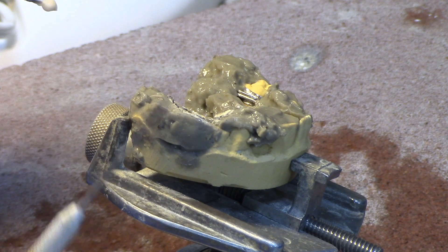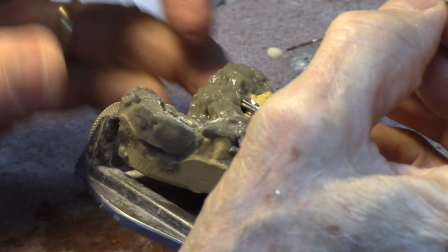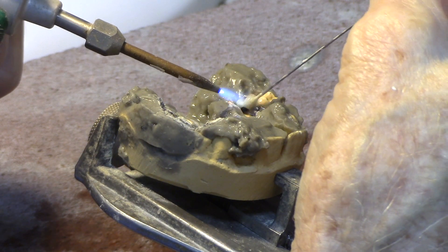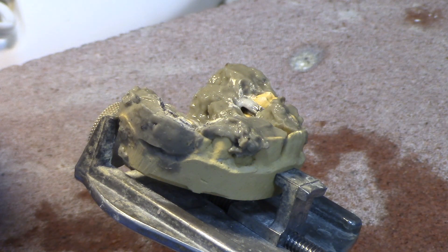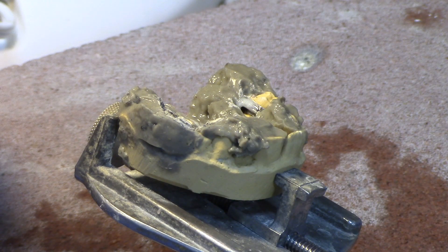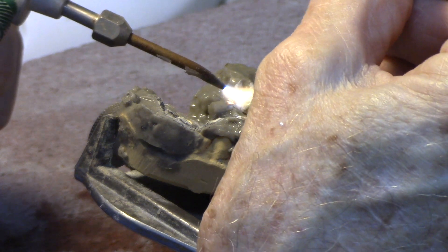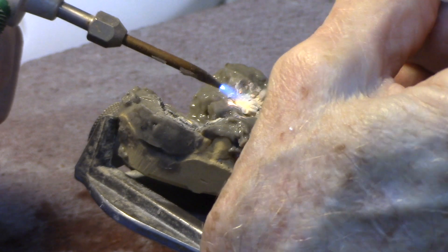I also keep my titanium heat probe around handy in case I need it. I have a video on that as well — solder doesn't stick to it, so you can use it like a little paintbrush to move solder around. Very handy to have when you're soldering. We sell that on the website as well.